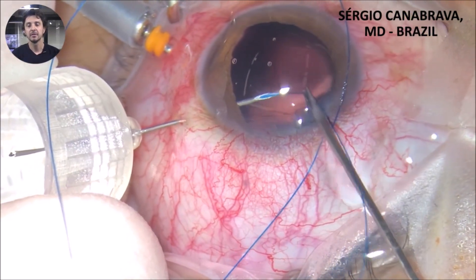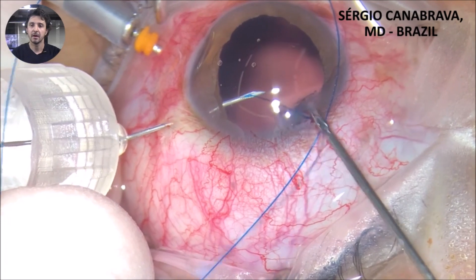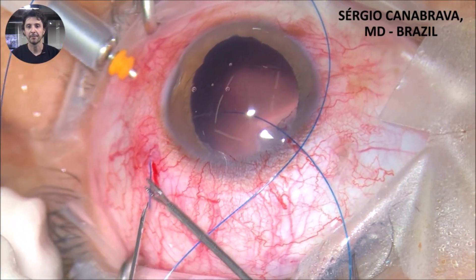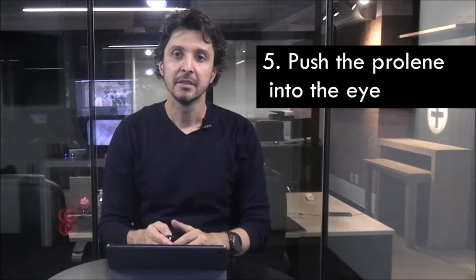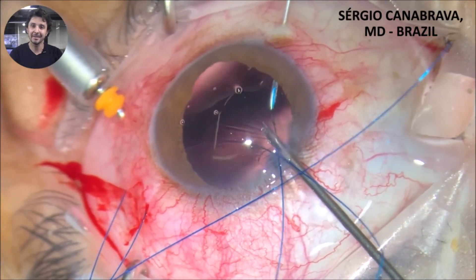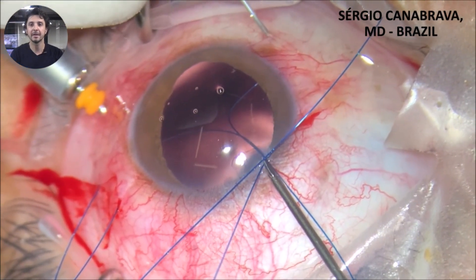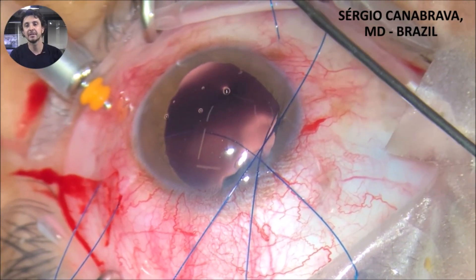Observe in this video how I am inserting the polypropylene inside the lumen of the needle. Tip 5: push the polypropylene into the eye. After I insert the polypropylene inside the lumen of the needle, I use my right hand and push the polypropylene inside the eye while I pull the needle outside of the eye with the other hand.